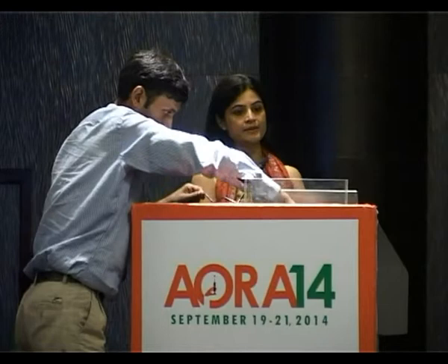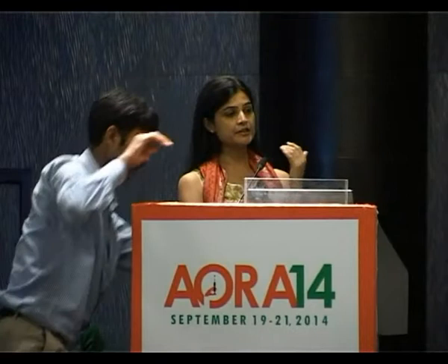Good morning. So let me get straight to the topic. Fascia iliaca blocks are really old blocks. They were described sometime in 1980 by Dalens. But in recent times, with the use of ultrasound, the ability to delineate fascial planes, the ability to visualize the tracking up of the drugs and following the catheters up, there has been a resurgence of interest and publications in the fascia iliaca blocks and the catheter technique.